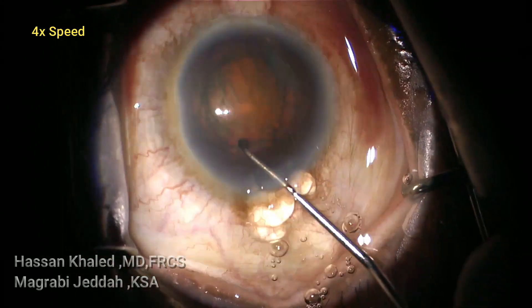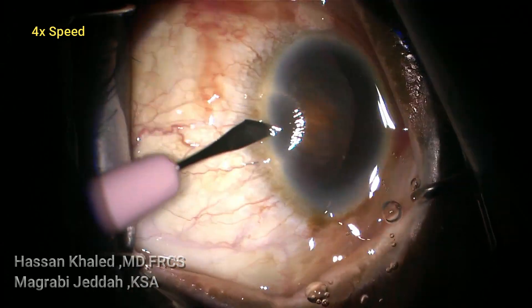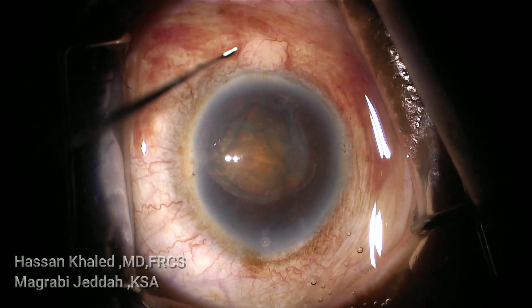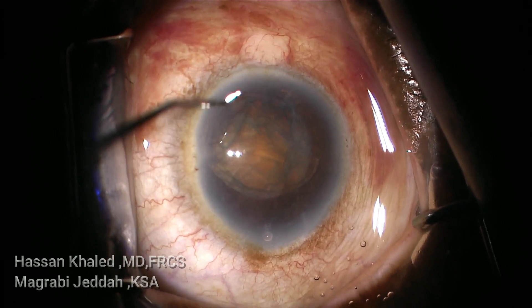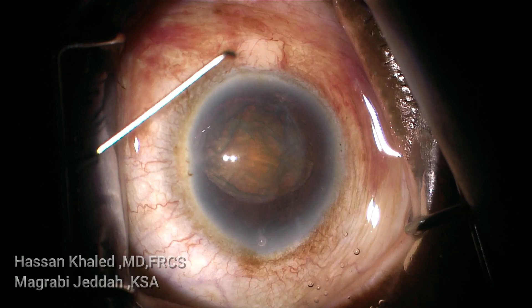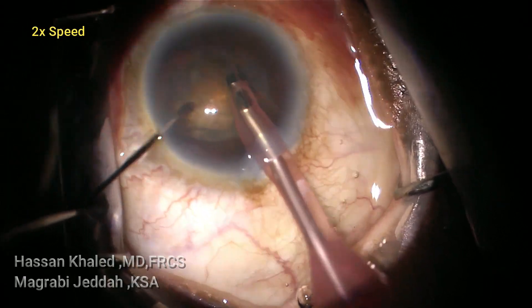You can see the fluid wave during the hydrodissection section, then injecting dispersive OVD and rotating the nucleus. Here you can see a sharp-pointed chopper. I'm going to do the vertical chop technique for this dense cataract.